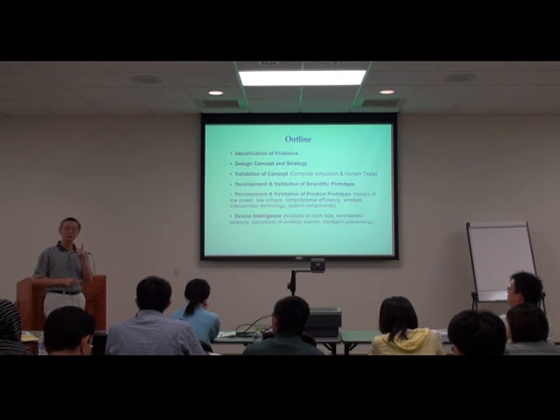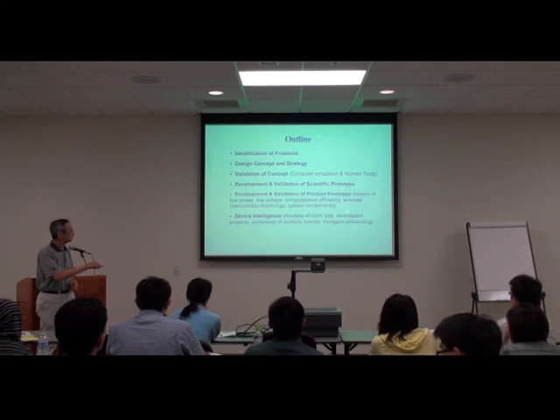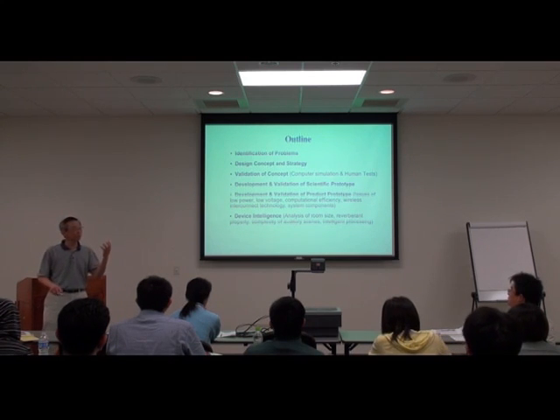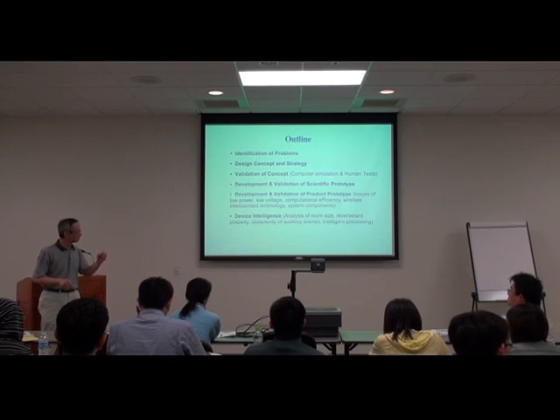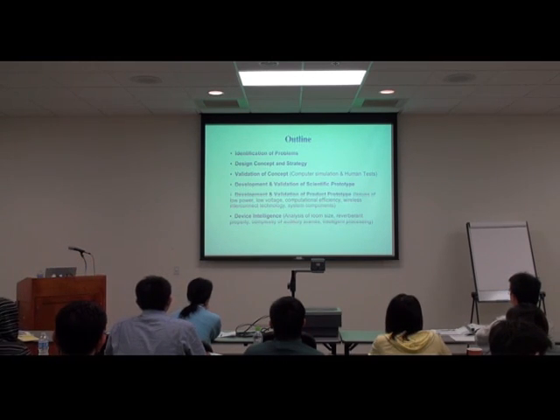You probably don't even know that you are doing that, but yet most of our devices don't have this intelligence. We don't have the ability to assess room size or room properties, or analyze the complexity of the auditory scene. Let's talk about scenes because we'll quickly go through that. And then what about intelligent processing?